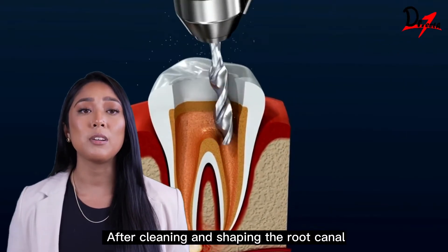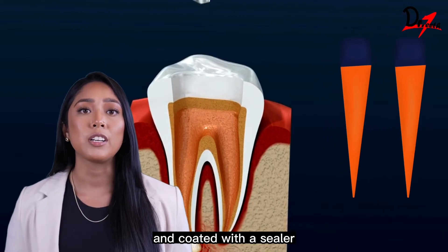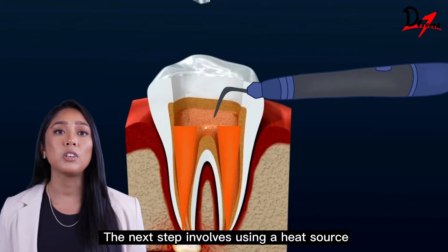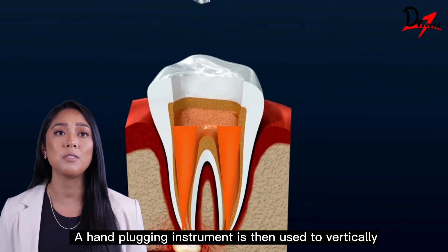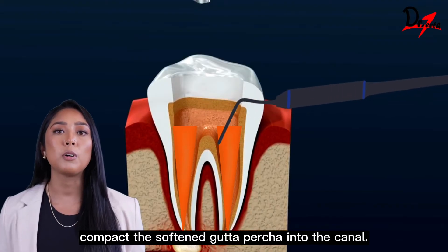After cleaning and shaping the root canal, a master gutta percha cone is selected and coated with a sealer for improved adhesion and sealing ability. A heat source such as a heat carrier or heated plugger is used to soften the gutta percha within the canal. A hand-plugging instrument is then used to vertically compact the softened gutta percha into the canal.